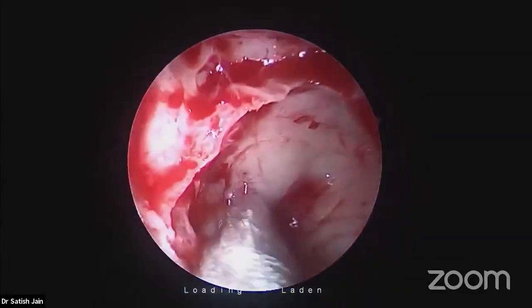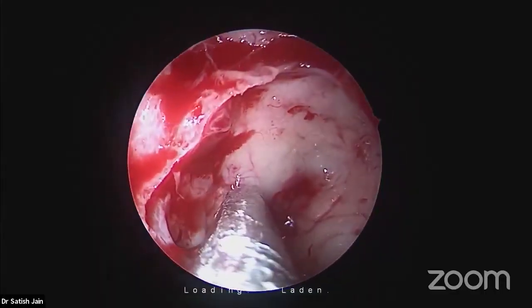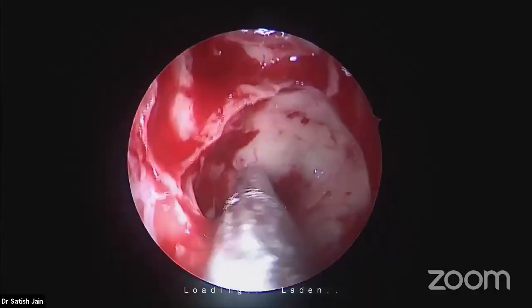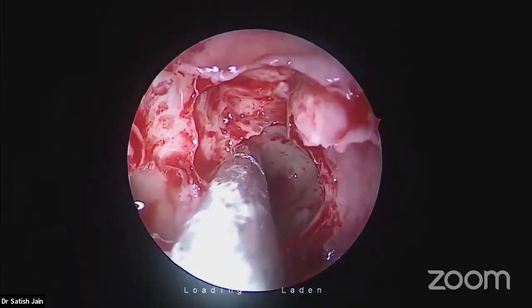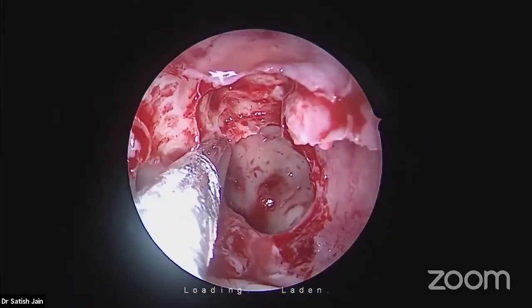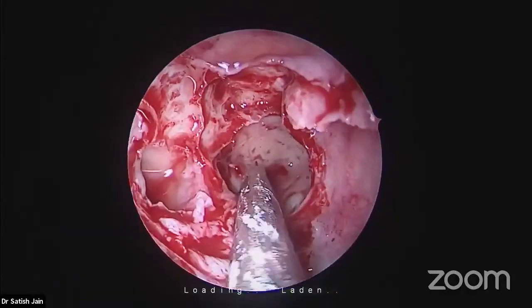This is my carotid prominence. Can you see this? Yes. See this bluish? And this is going to be the optic nerve prominence. Yes. From here to here, this is carotid.